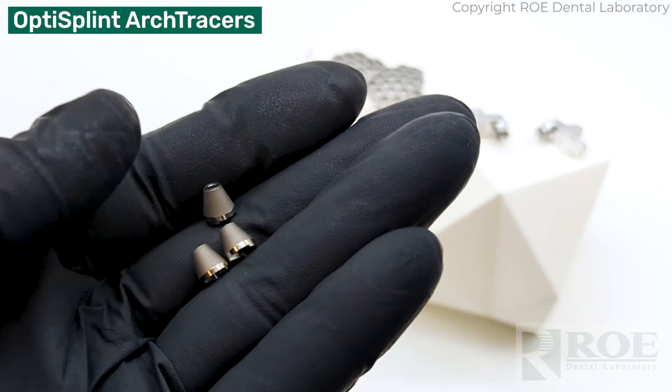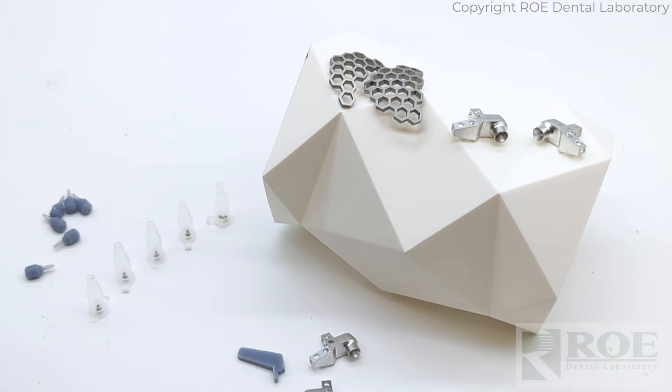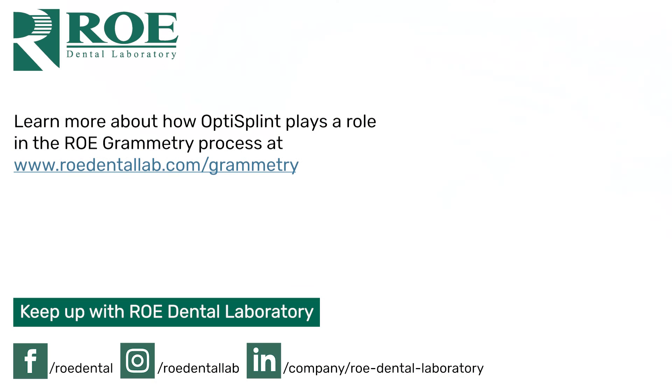Arch tracers are sold separately. And that is the Grammetry OptiSplint kit.